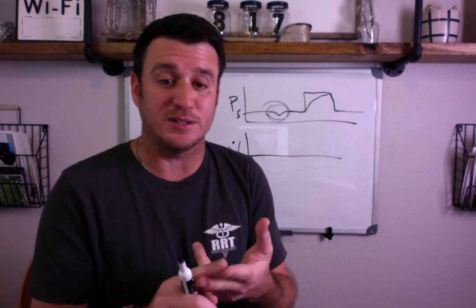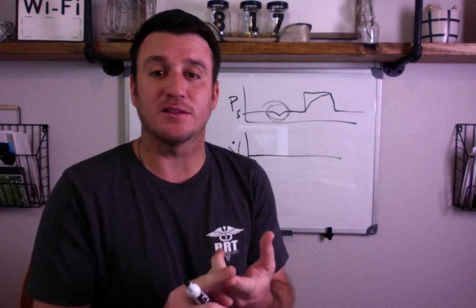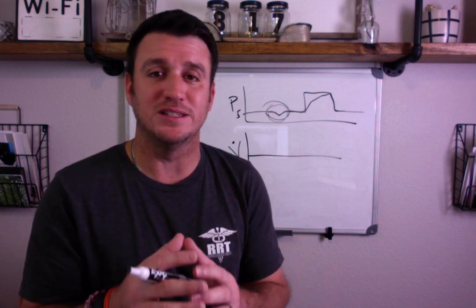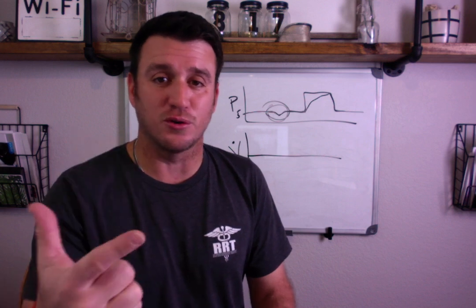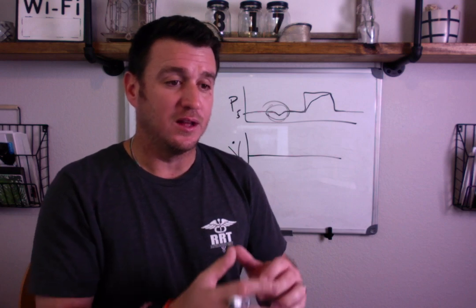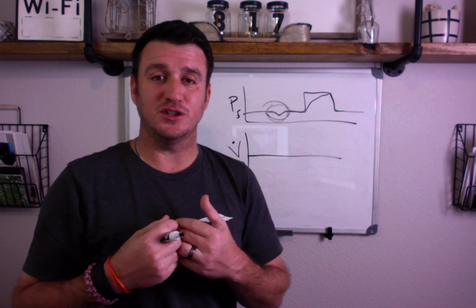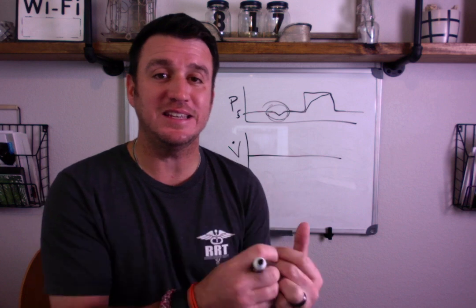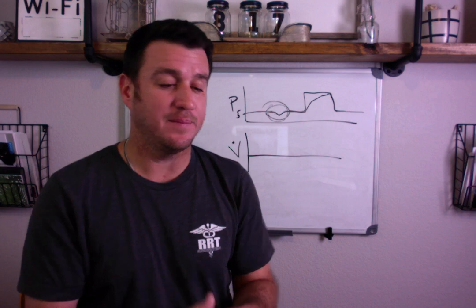So you've got two options. Either make the vent do what the patient wants, or knock out the patient's drive, which studies have shown is never the best way to deal with asynchrony. It doesn't lead to shorter vent days. It doesn't lead to shorter ICU days. And so increasing sedation to create synchrony should not be your first goal from a respiratory therapy standpoint. Your first goal should be to see if you can make this ventilator do what the patient is wanting to do. Okay, so that's the first thing I leave there.